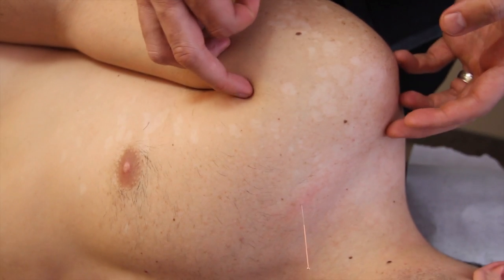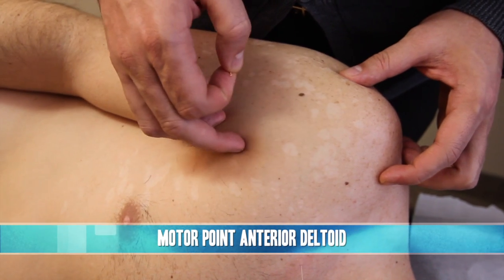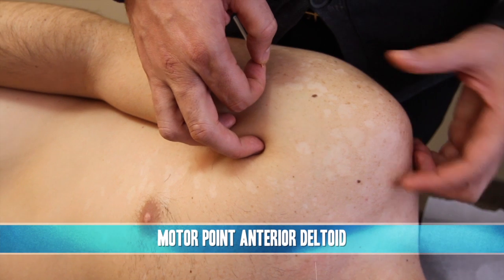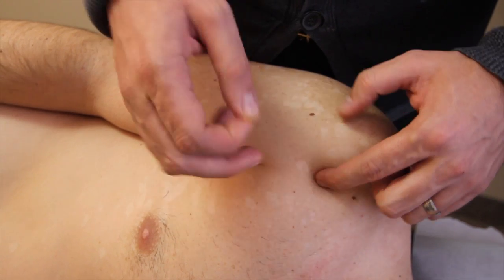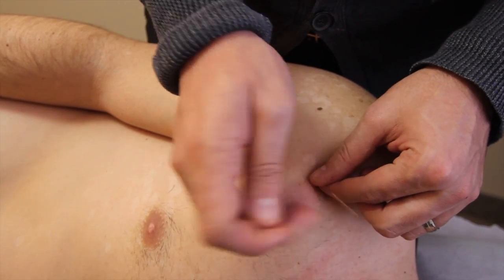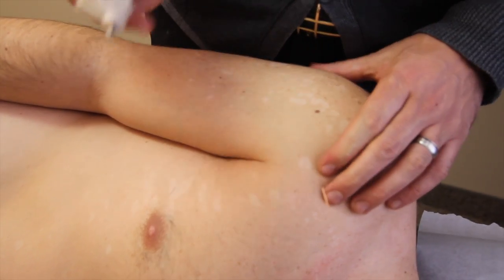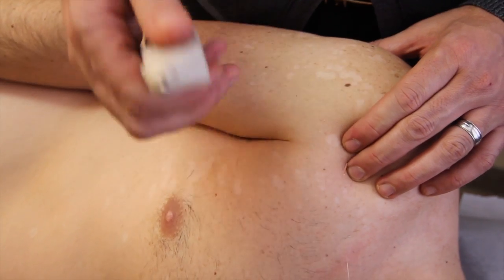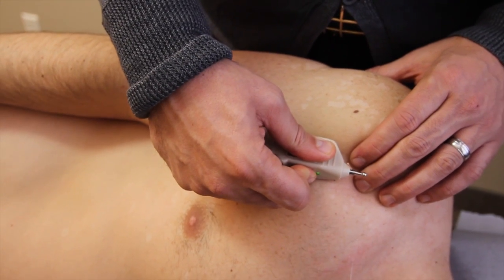I'm going to focus on the anterior fibers of the deltoid — mid-anterior axillary line, acromion, bisect it, insert based on the size of the patient, stimulate, and we get internal rotation.